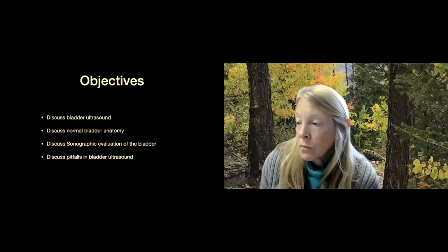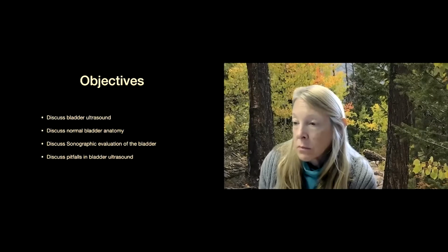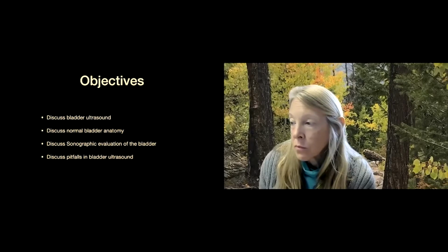Then we're going to take that and talk about how we scan the bladder. What are we looking for? What measurements are we going to do? And we'll wrap it up with a few pitfalls as we scan bladders, to decide whether we're doing this appropriately and getting the right answers for our patients. So with that said, let's dive right in.